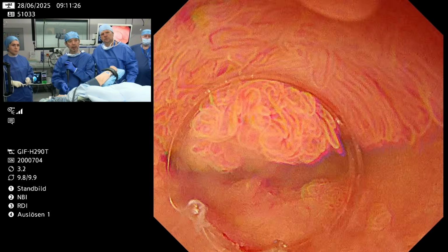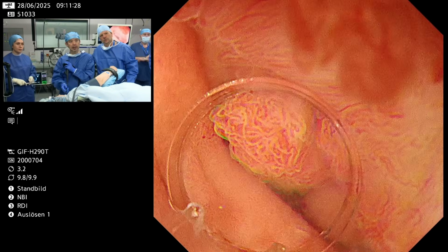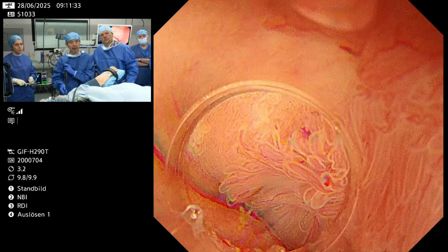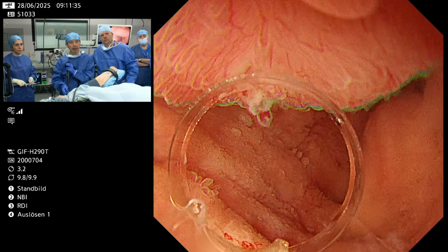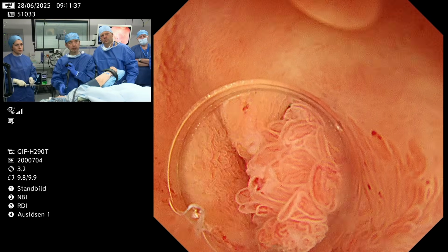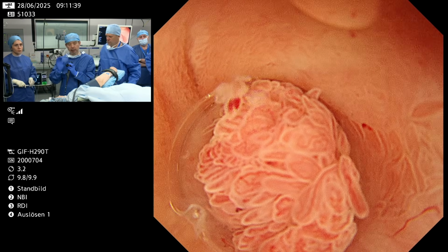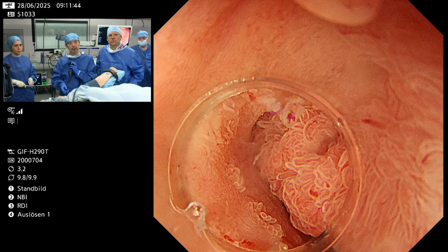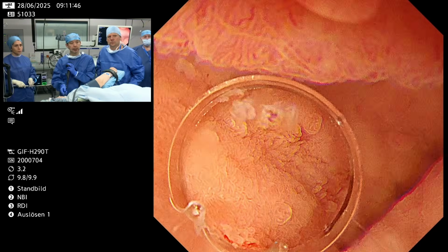So even if I encounter severe bleeding, I can flush away the blood and stop it. It is relatively convenient. And the rigid part of this endoscope is relatively short, and the down angle is 120 degrees, which is also really good for a therapeutic endoscope.